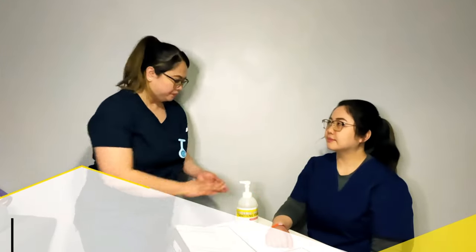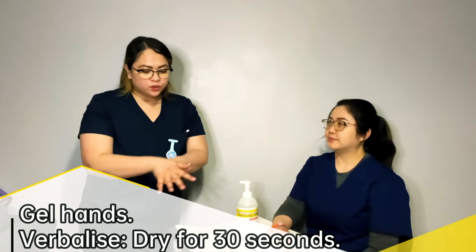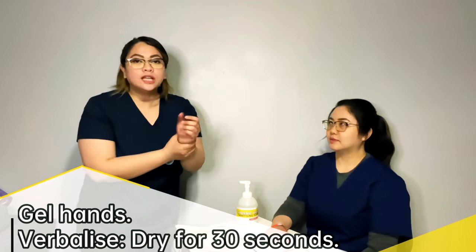Let's do it. So before approaching the patient, I'm just gonna gel my hands. Right backward and forward, swap from palm to palm, right palm over the left dorsal and vice versa, fingers interlaced, back of the fingers interlock, rotational rubbing of the thumb, rotational rubbing finger clasp, and rotational rubbing of the wrist. Let it dry for 30 seconds.